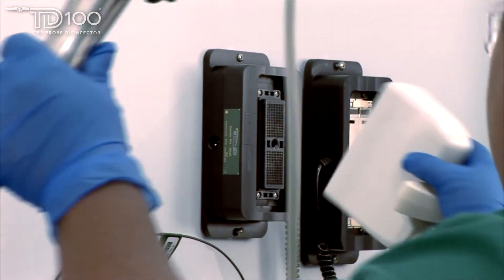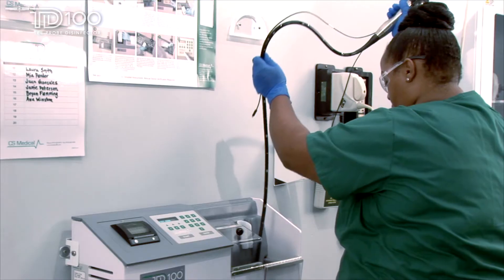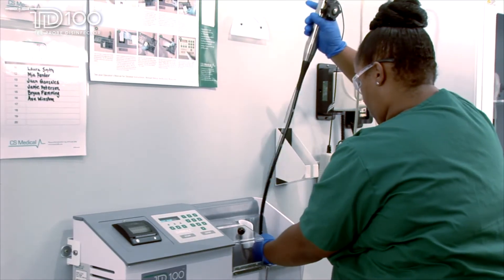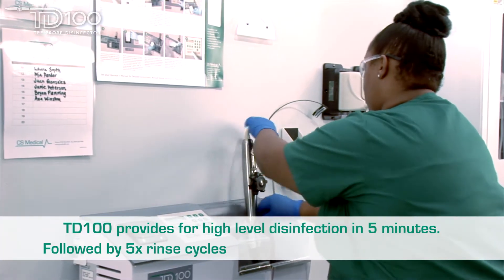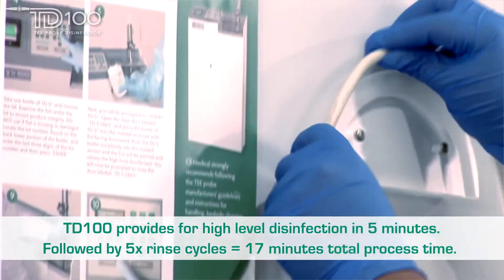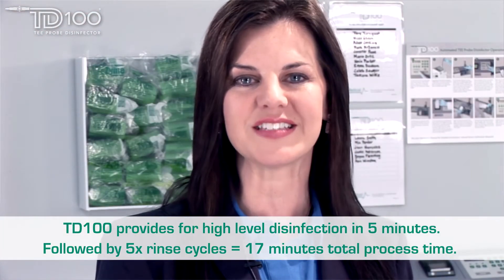Once the probe has been manually cleaned, you will follow simple step-by-step instructions found on the TD100 LCD display. The TD100 will perform high-level disinfection of the TEE probe in five minutes, followed by five rinses, for a total process time of 17 minutes.